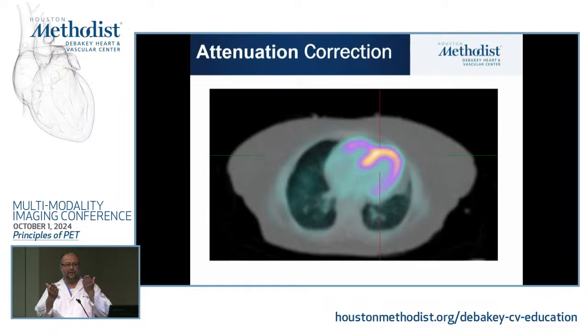We hope the patient didn't move, and then we take these two images and superimpose them on each other. Obviously, whenever you have two sets of images that you're superimposing on each other, you always run the risk that the patient moves in between, and whatever you superimposed didn't work that well. So you can potentially run into some artifacts.